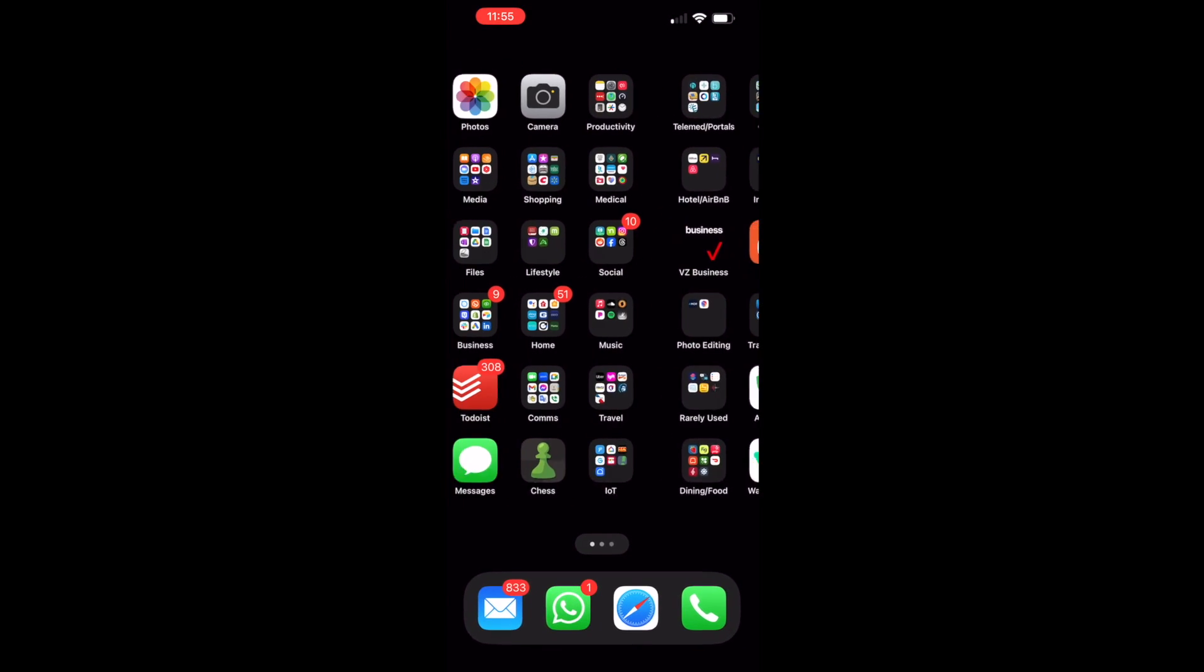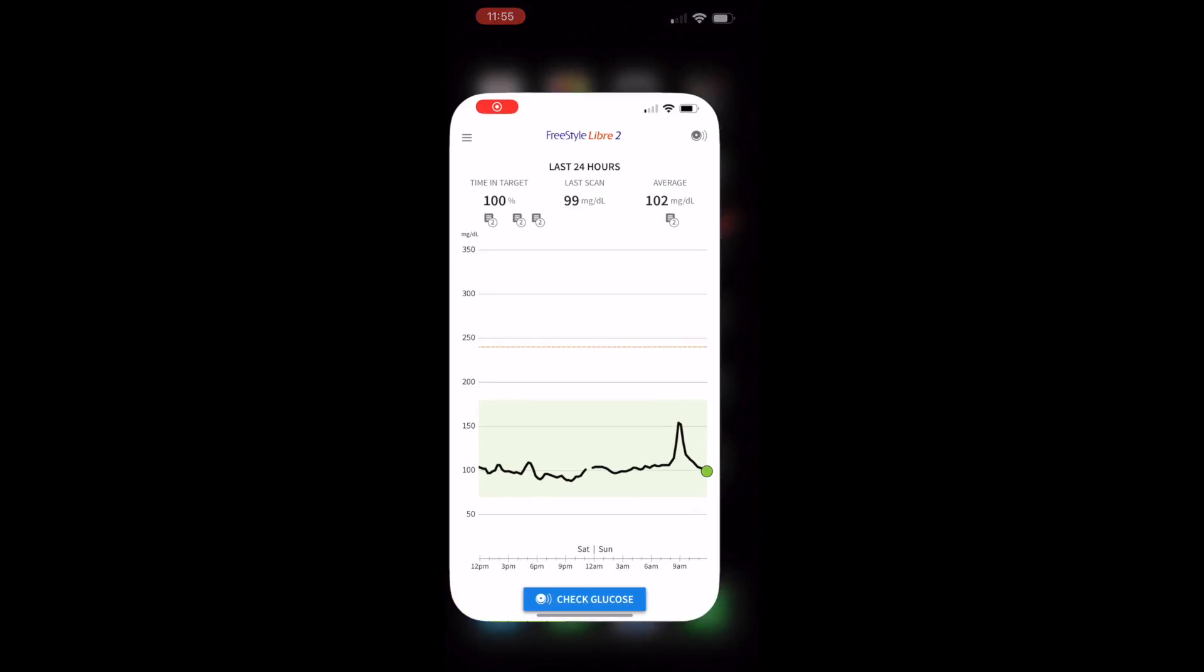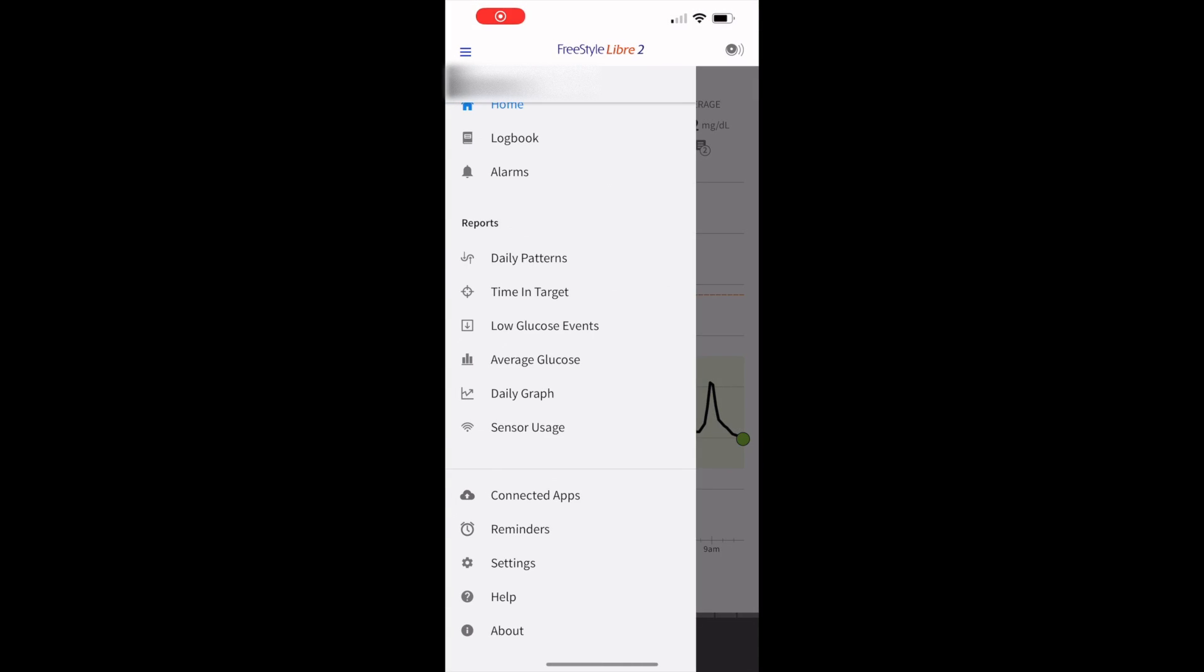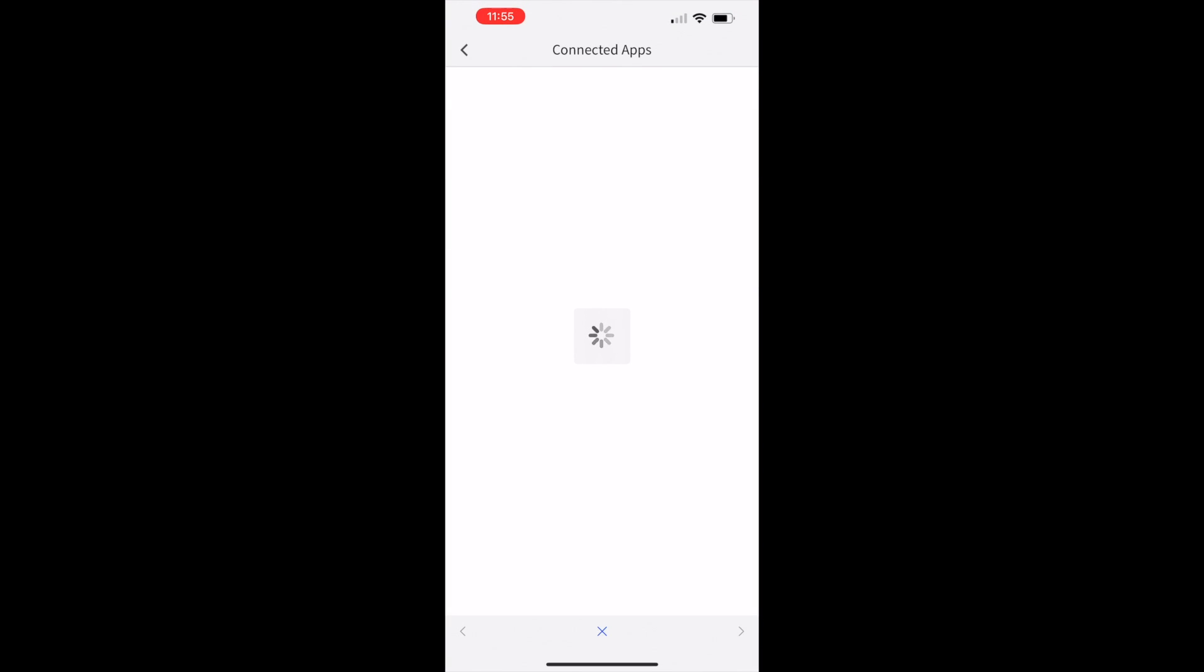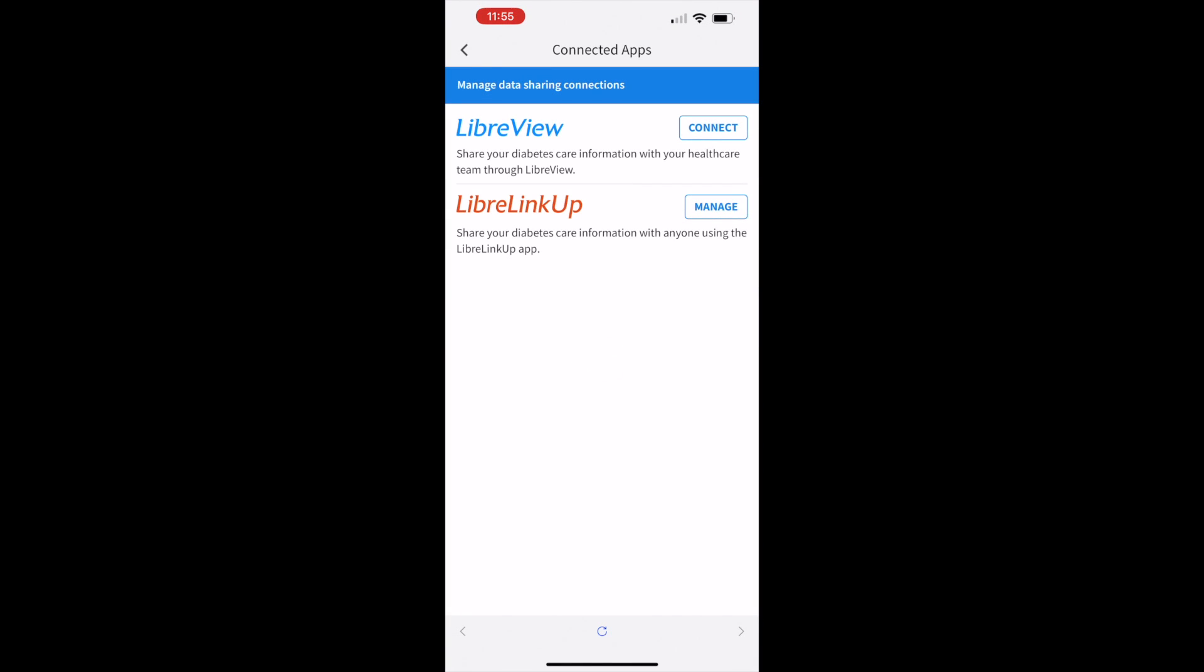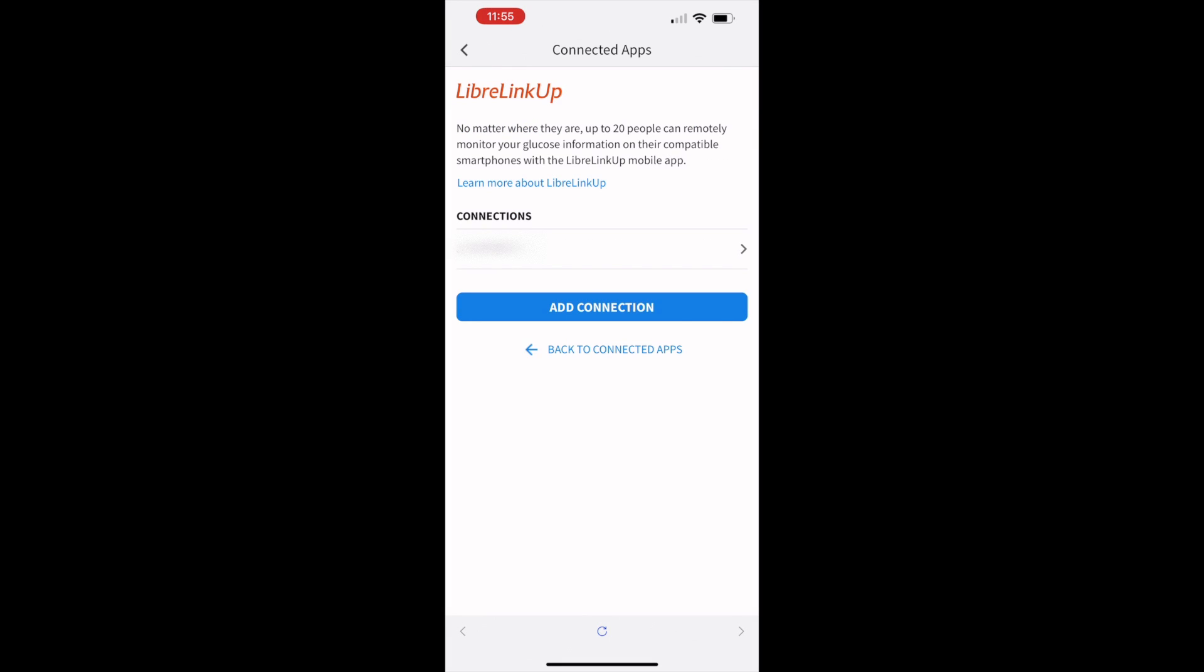To add that connection, go into your Libre app Settings, under Connected Apps. You'll see Libre Linkup and Manage where you can invite the connection. That's how to do it.